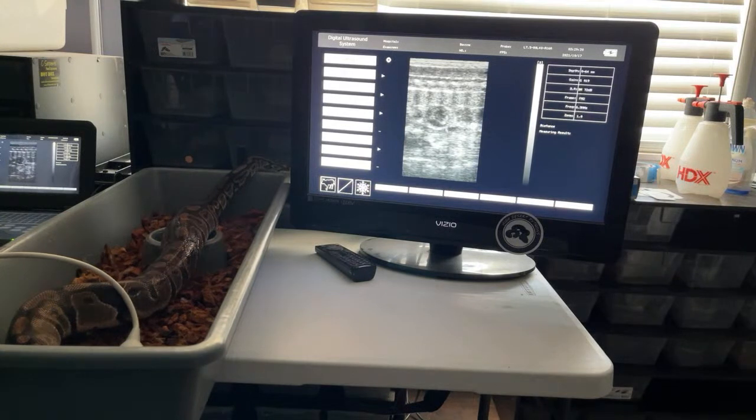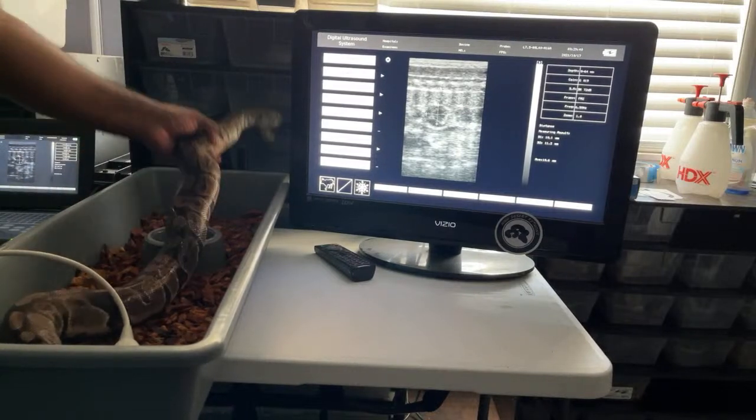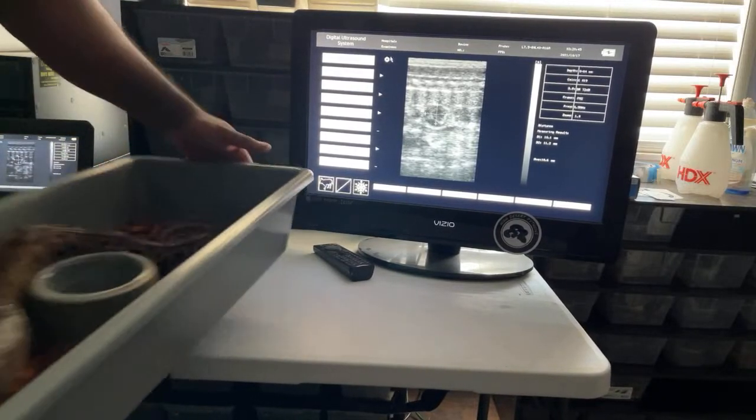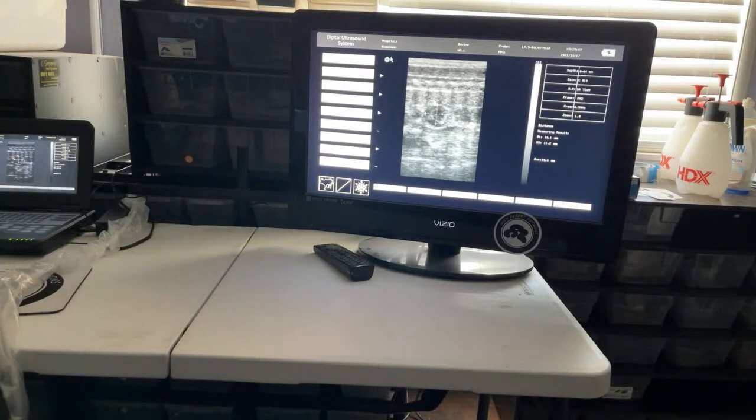Set down a little bit far. About 10.6 average. So, yeah, she's one of those this-time-of-year girls, too. So, sometime like this time next month, she'll have probably 12 or 13 millimeters. So, I put the Hurricane to her. Running like Antoine running his mouth with bad daddy. Yeah, Stevie. Alright.